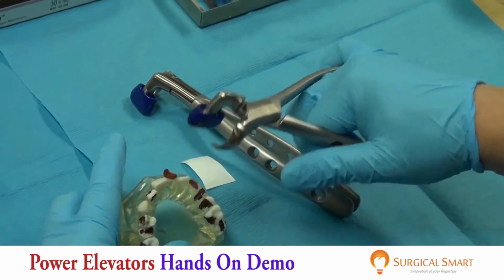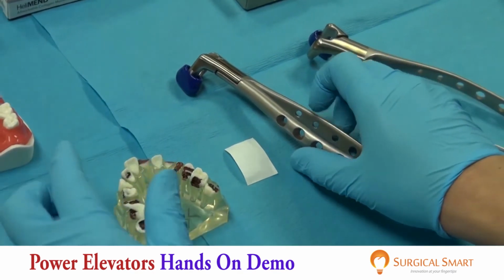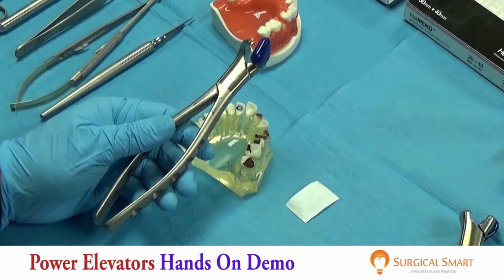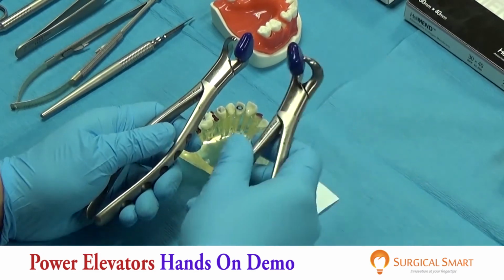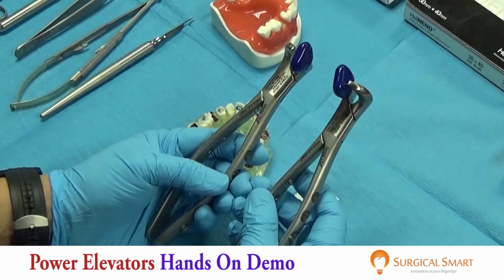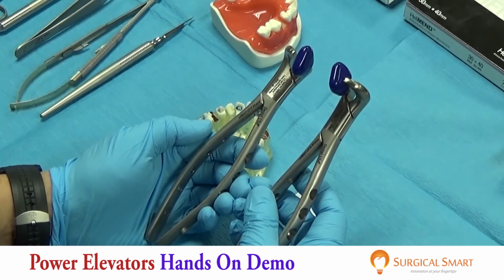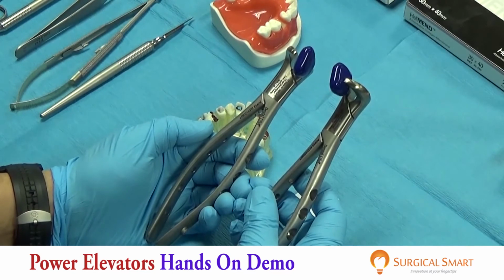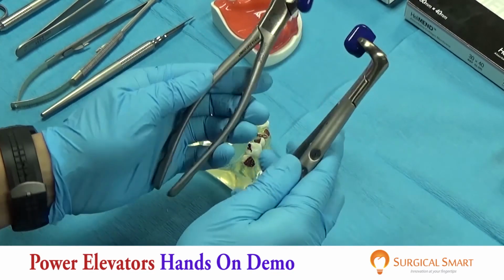Okay? So essentially what I'm trying to say is that with the physics forceps, you basically needed 4 forceps to get the job done. You needed left, center, right for the maxillary and 1 for the mandible. With the power elevators, you only need these 2, and you can take out just about any tooth that is in the mouth. So having said that, this is my bread and butter. This is my go-to for any extraction.